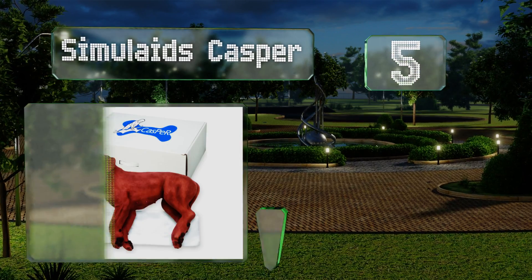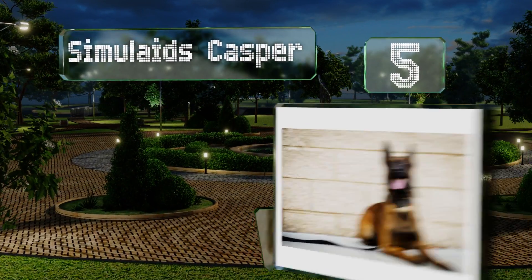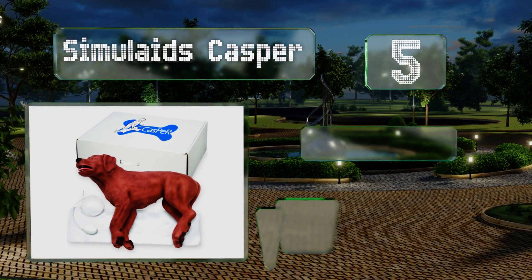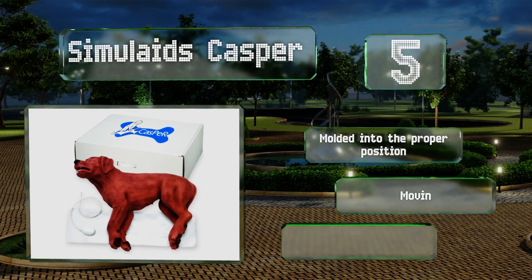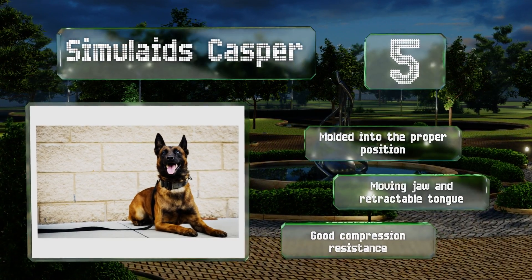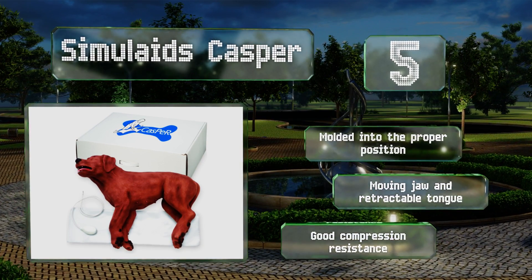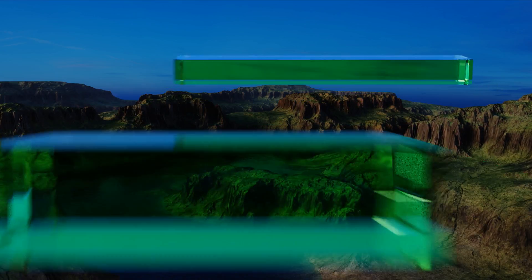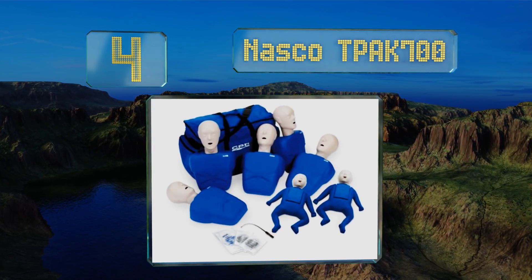At number five, considering the prevalence of pets in the United States and how integral a part of our family they become, more people should know how to resuscitate a dog. Luckily, the Simulaids Casper makes learning how to do so a relatively easy task. It's molded into the proper position and is equipped with a moving jaw and retractable tongue. It offers good compression resistance.